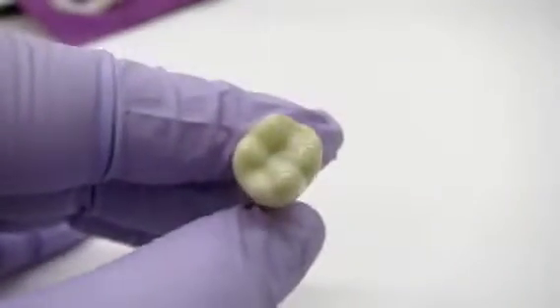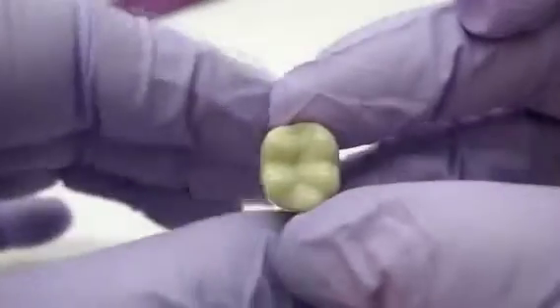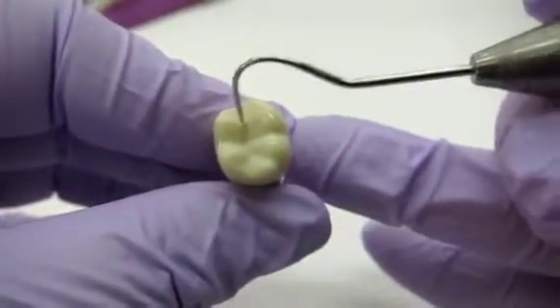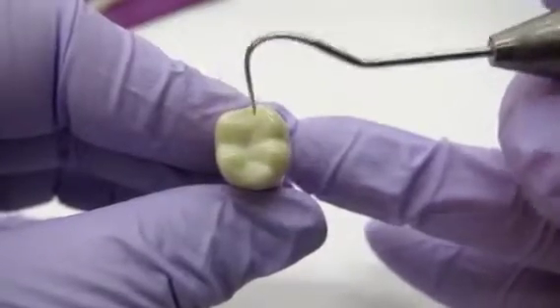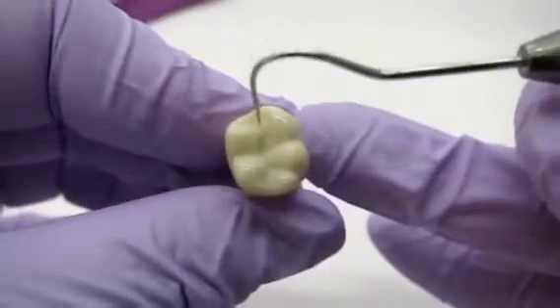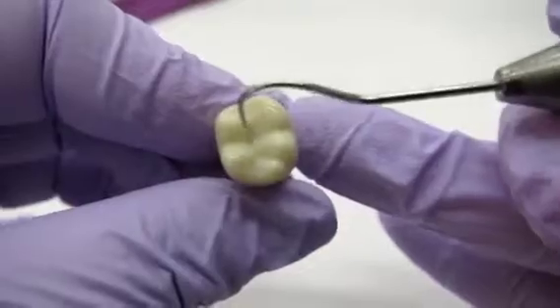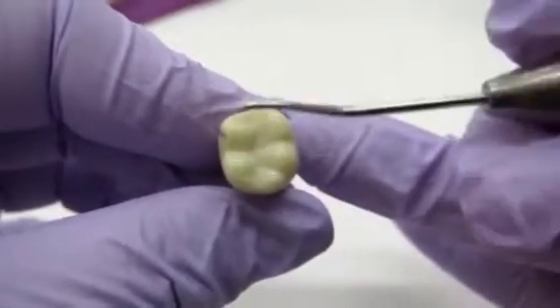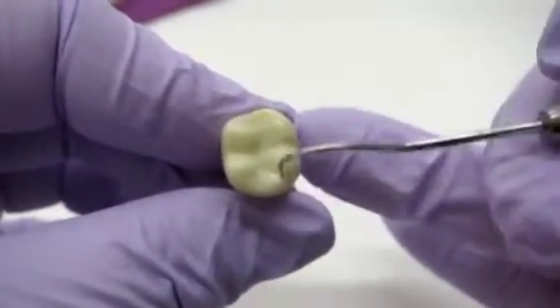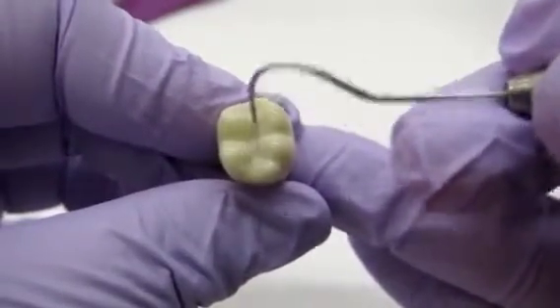So actually before we start, we're going to go over dental anatomy because it's really important. We're going to be restoring tooth number 30. The first thing we want to look at is the central groove. I see a lot of people when they start restoring these teeth — they actually make a big plus in the middle. And if you look really closely, it's not a plus. It's a zigzag, or an M. So do not go straight ahead and make a big plus because it's not going to look like a tooth. Central groove is zigzag.